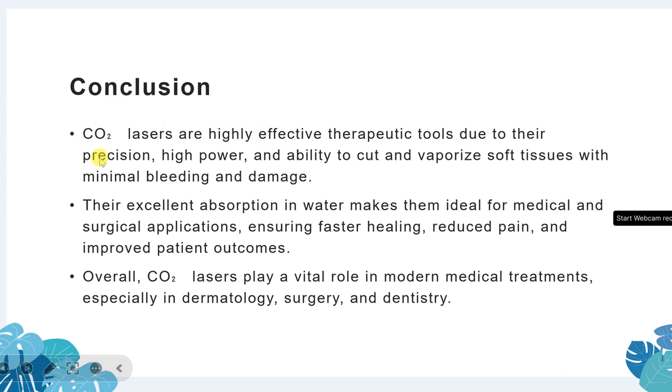And this is the conclusion. The CO2 lasers are used mainly to avoid more pain and more bleeding. Right? This is the main advantage. Their excellent absorption in water makes them ideal for medical and surgical applications.